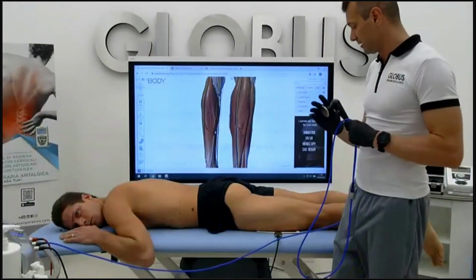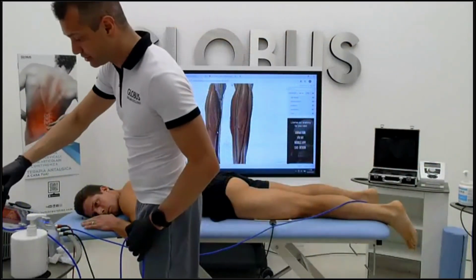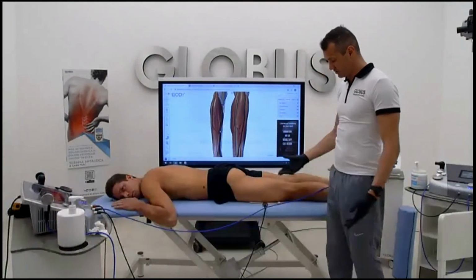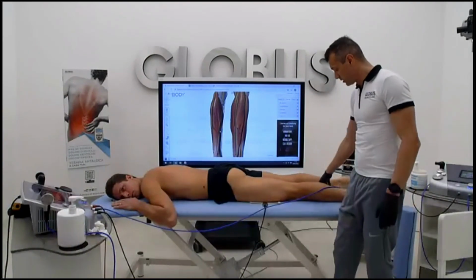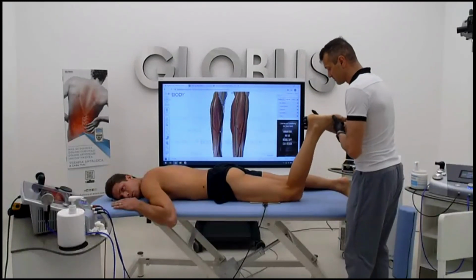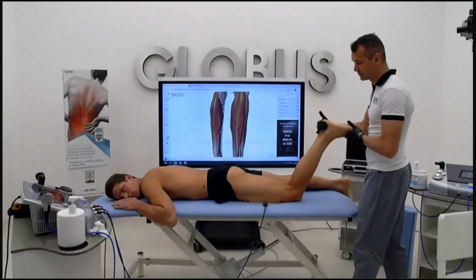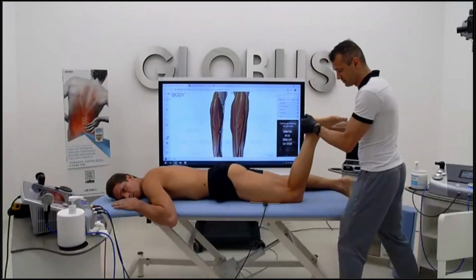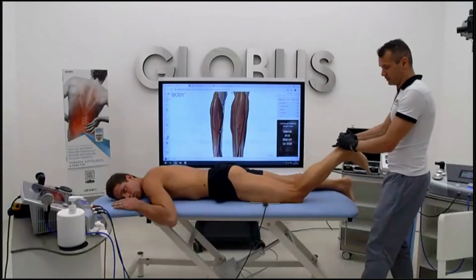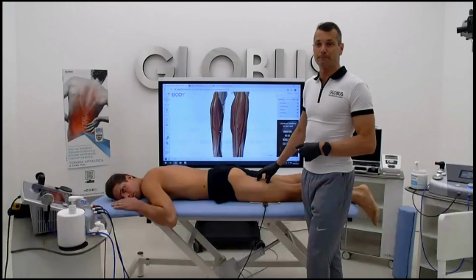Maybe in the third or fourth day after the lesion, I can also use the fascia tools. But about the positioning, this is the right positioning because we have a transversal geometry. The plate is under here, so it's very easy to set up the treatment. Also for the second phase of the treatment, we can use exercises toward the gluteus with the concentric phase and also with the eccentric phase. Bring toward the gluteus, resist. Okay. Again. Bring toward the gluteus. During these exercises, we can also have the therapy over the lesion site. It's very easy.